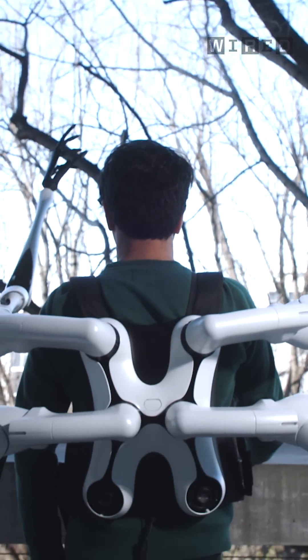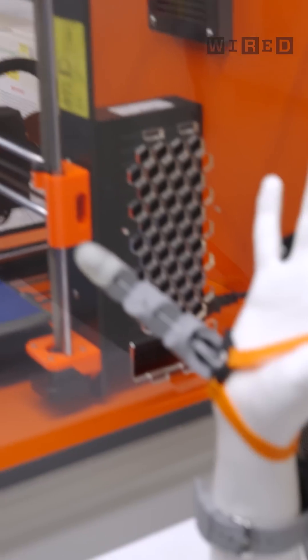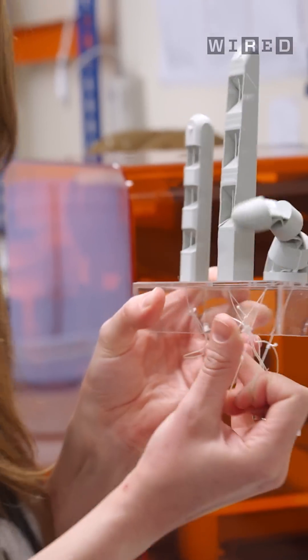After trying the robotic arms in Tokyo, I headed closer to home to Cambridge to meet with Danny Clode and the team that is working on a third thumb. That's right, a third thumb. Danny Clode is an augmentation and prosthetics designer at the University of Cambridge's plasticity lab.